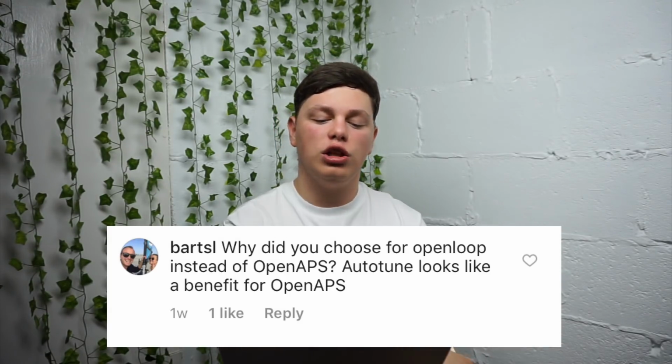Next question, why did you choose loop instead of OpenAPS? Auto-tune looks like a benefit for OpenAPS. So a couple of reasons. First reason is I'm an Apple person, and I am deep into the Apple ecosystem with a watch, iPhone, iPad, etc. I know some people choose to just get a special Android phone, but I didn't want to do that.